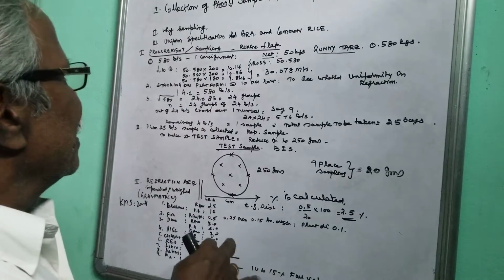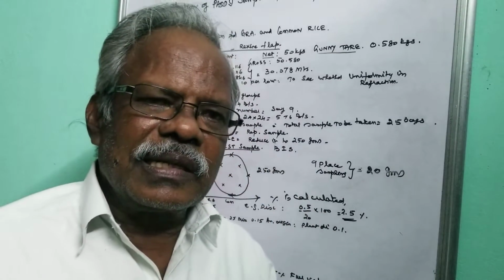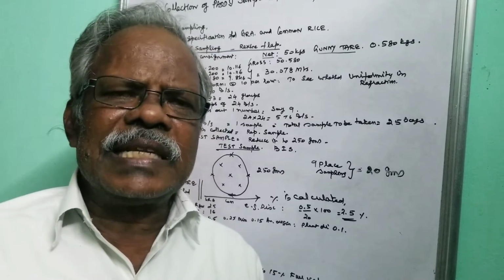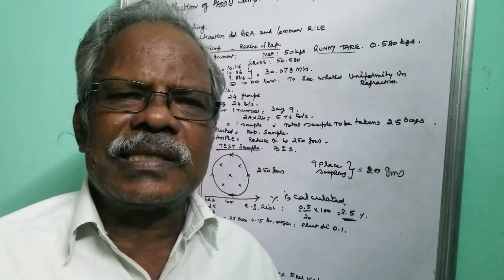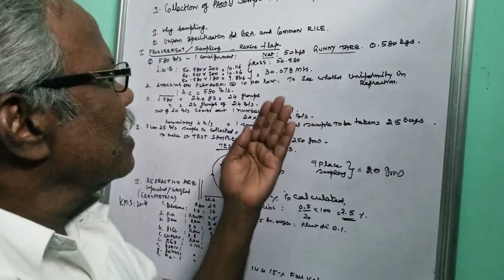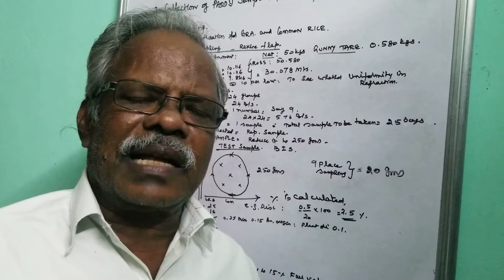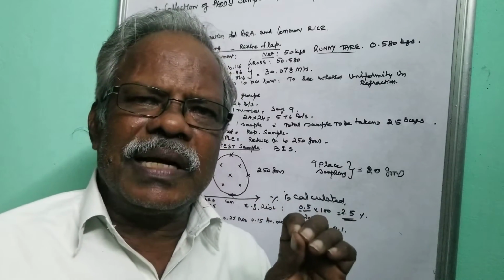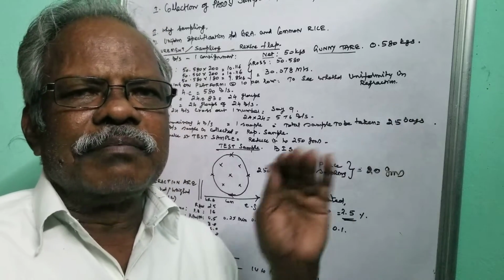Now we will see how sampling is taken in procurement. Usually in procurement, we receive the rice in bagged form. The bag should have a stencil and a color code to indicate the particular crop as well as the variety, grade A or common, and also a Rexin flap. That flap is stitched along with the bag at the end after filling the rice. That flap will contain the mill name, commodity, variety, crop year, and net weight.